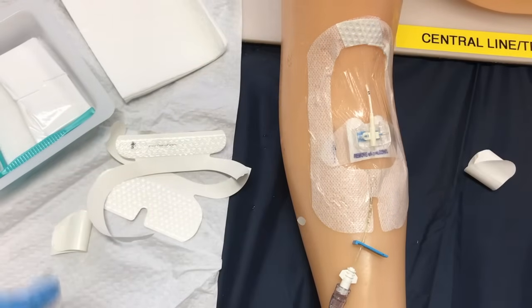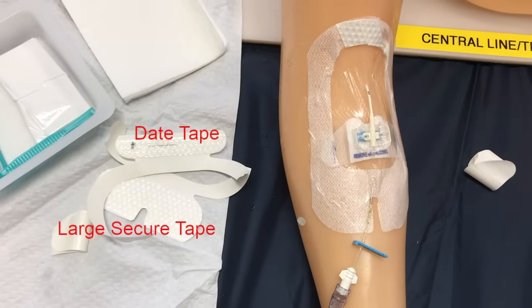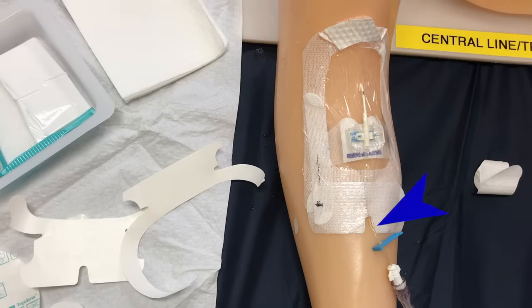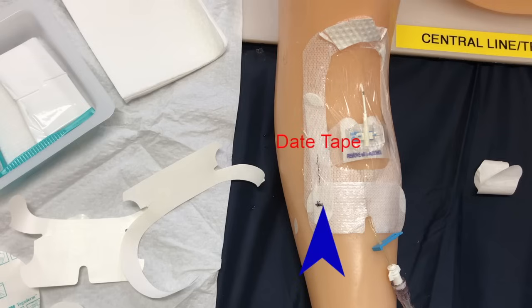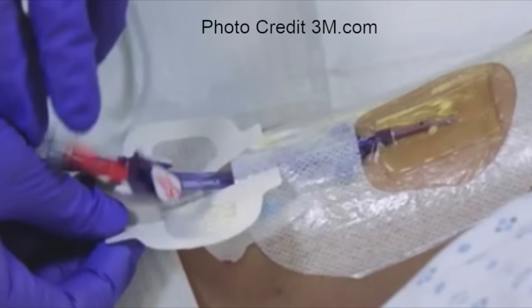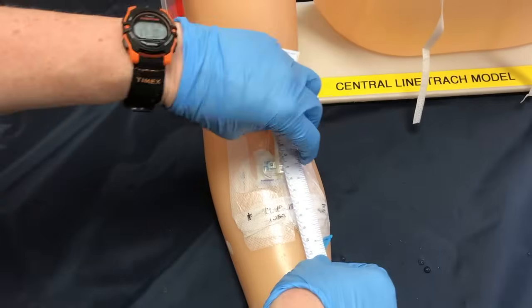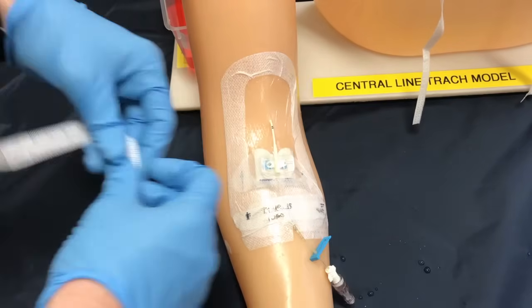We still have two tapes left to apply: the large secure tape and then the date tape. When working with the IV advanced Tegaderm, your large secure tape will be placed on top of your original dressing such that the U's will line up for the opening and it will secure your catheter in place. The date tape is then filled out and applied along the white border of your dressing. If your facility uses a different dressing, you may place the large secure tape underneath the IV catheter lines to secure it with the U shape pointing up. Last but not least, we're going to redo our measurement to ensure the post-dressing measurement is the same as our pre-dressing measurement.